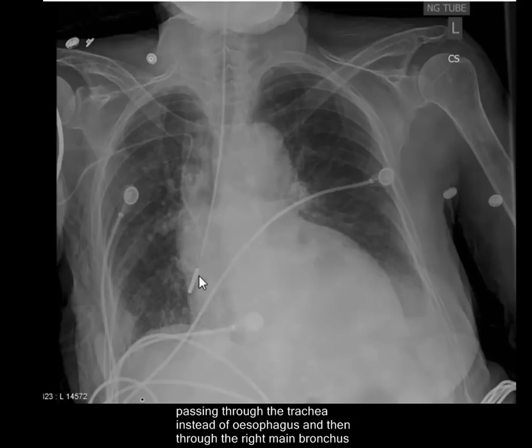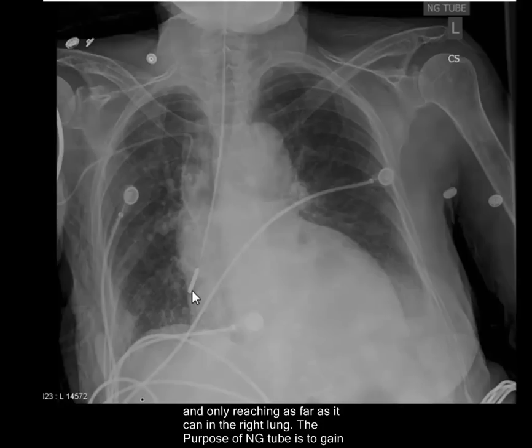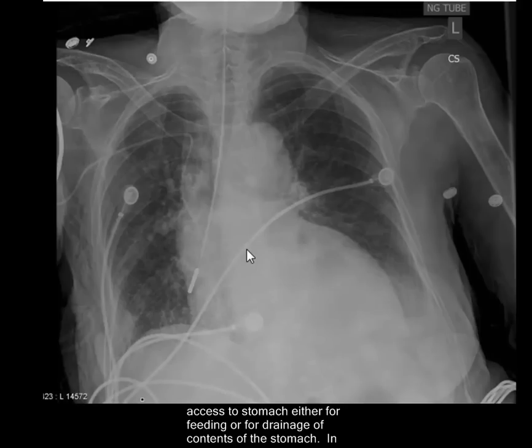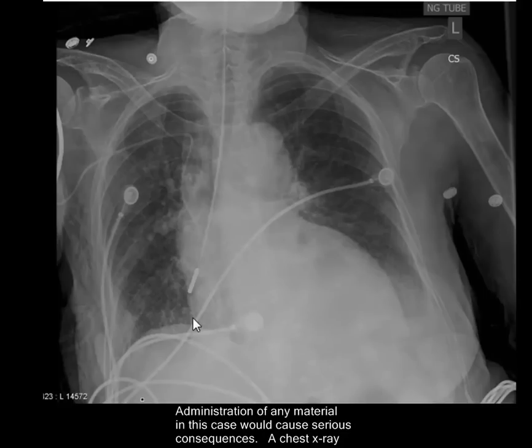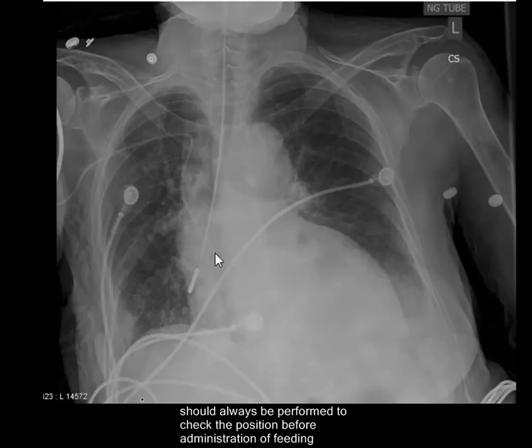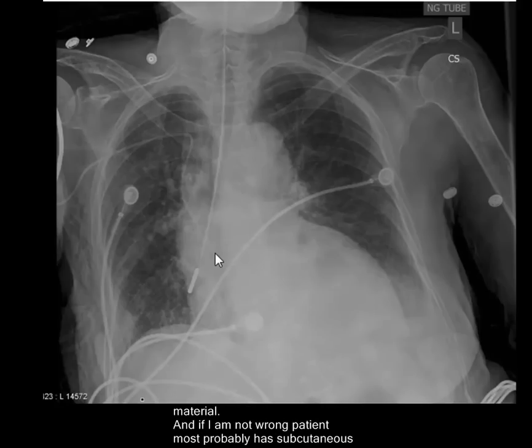The NG tube is going through the right main bronchus and reaching as far as it can into the right lung. The purpose of an NG tube is to gain access to the stomach either for feeding or for drainage of stomach contents. In this case it was inserted for feeding, as the patient has had a stroke and is unable to feed. Administration of any material in this position would cause serious consequences, as the tip is in the right lung, not the stomach. X-ray should always be performed to check position before any feeding material is administered.